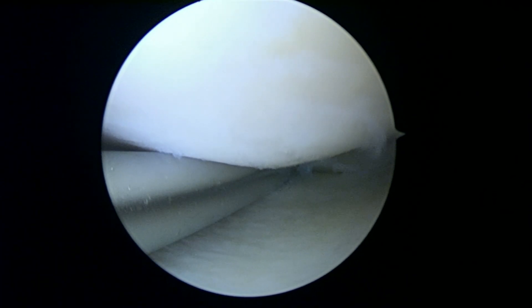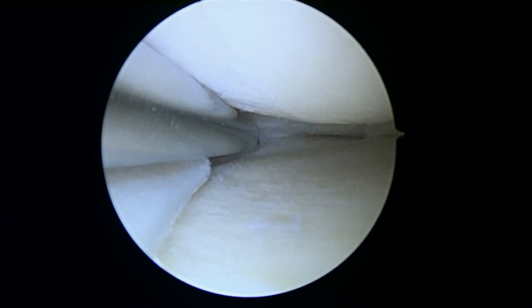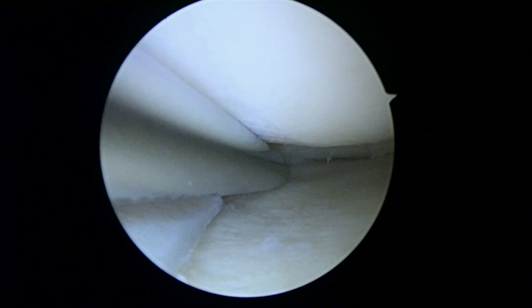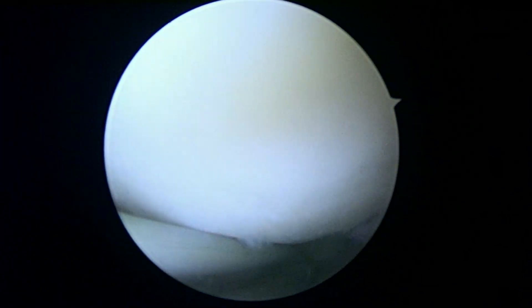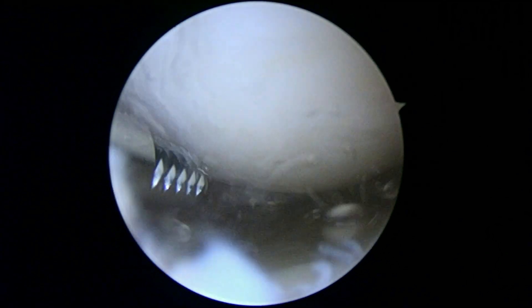We've trimmed out the part of the meniscus that had that little undersurface tear. There's a pretty good shot of what we've done right there. We're just kind of polishing or fine tuning it now, making sure there's no more loose pieces floating around. I think we've got everything irrigated and flushed out. The good news is your recovery is going to be a lot quicker.